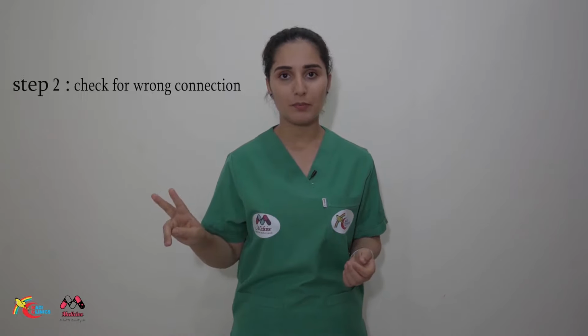The second step is checking for wrong connection. This can happen when the ECG leads are misplaced. To do that, you will look at lead 1 and AVR. Lead 1 should always be positive. So you'll look at the P wave.